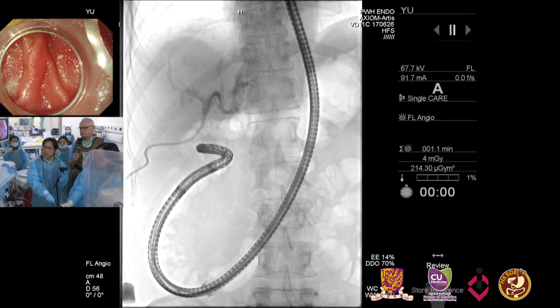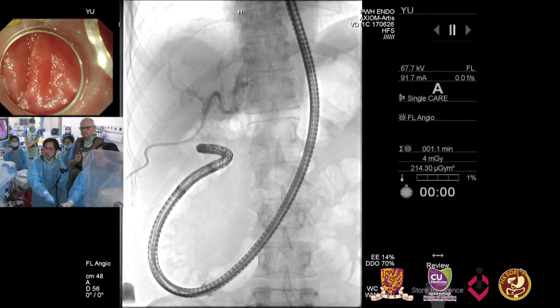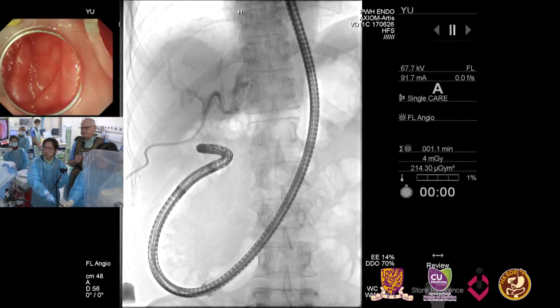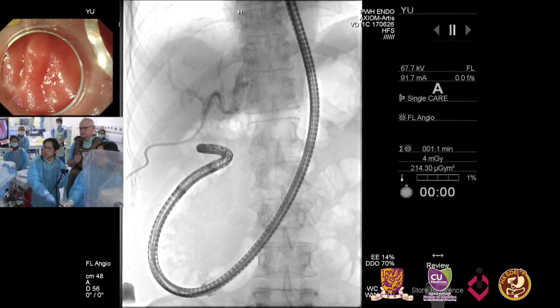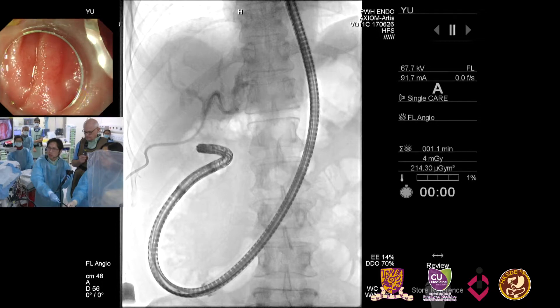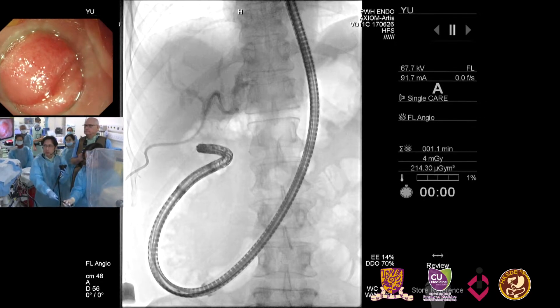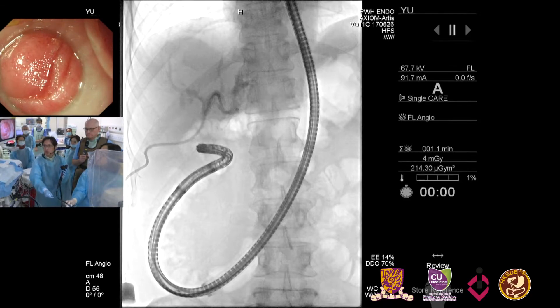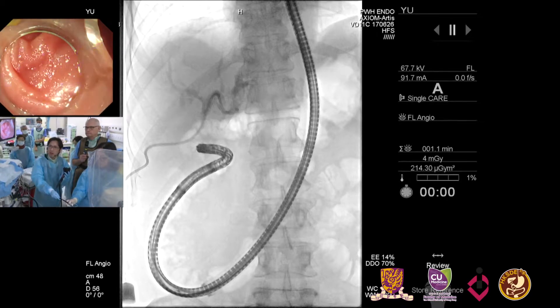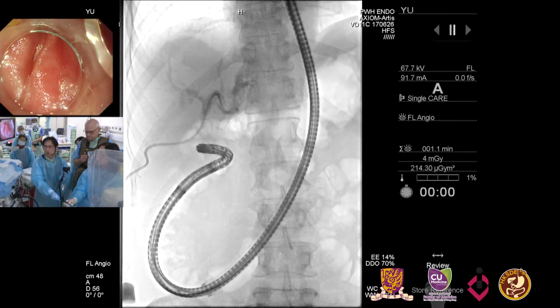As you can see here, I have started the procedure. I injected some contrast through the PTBD just to show there are some filling defects in the bile ducts — these are intrahepatic ducts — and there is some flow of contrast into the small bowel. What I'm going to do is try to follow the afferent limb and go up to the hepaticojejunostomy. The hepaticojejunostomy could be in an end-to-side configuration and hidden behind folds, making things difficult. If I can't find the orifice easily, I may inject contrast through the PTBD to give a roadmap or feed a wire if necessary.